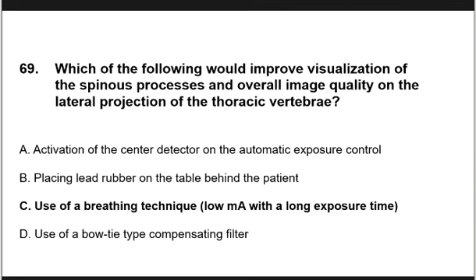So gagamit din tayo ng low MA with a long exposure time. Yan, so breathing technique. Isa sa mga projections na ginagamitan ng breathing technique, that is lateral projection of the thoracic vertebrae.